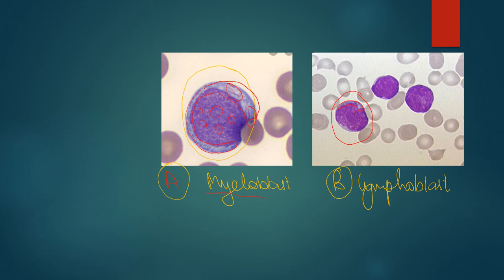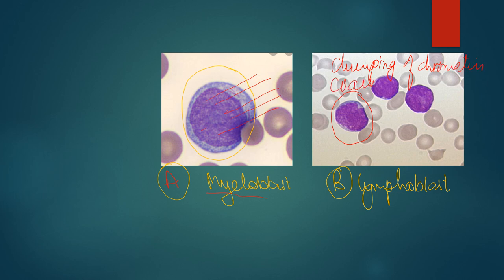It can be difficult to differentiate the chromatin — finer or coarser. Can you identify the finer chromatin in this myeloblast? You can see this slightly whitish, transparent, open type of chromatin in the myeloblast compared to the lymphoblast where clumping of chromatin has taken place — that is the coarser chromatin. If you are a new student, it may be difficult to appreciate this difference, but on this image you can see somewhat open, transparent, finer chromatin compared to the clumping of chromatin in a lymphoblast.